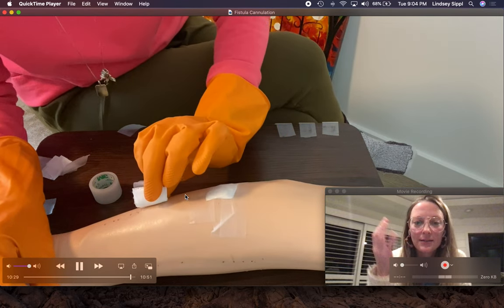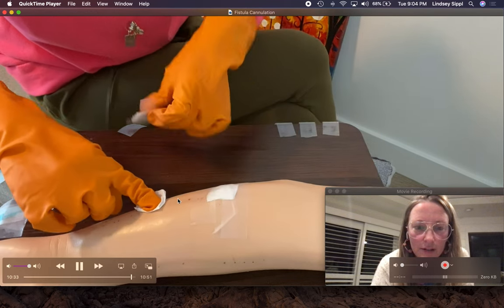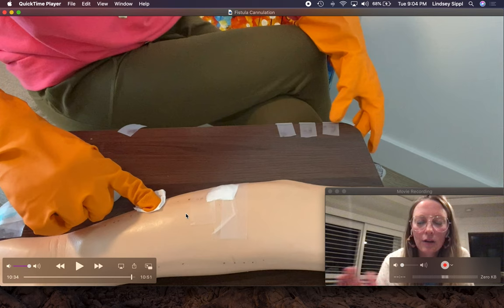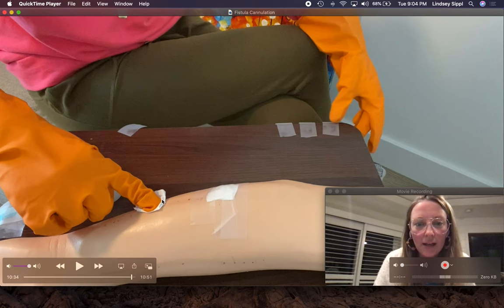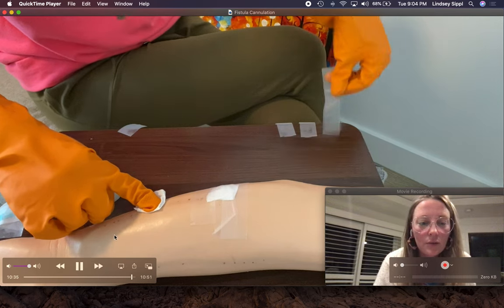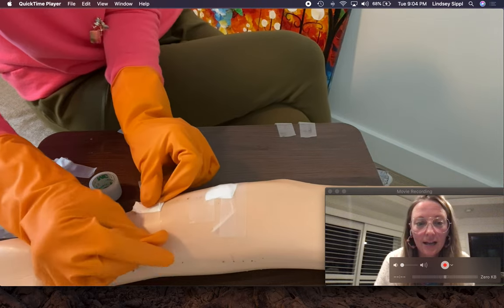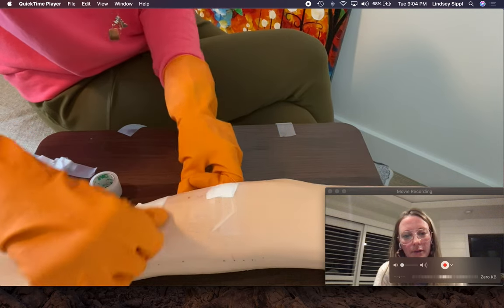I've got all my PPE on — my mask, shield, and lab coat — and I'm going to check to make sure they're not bleeding. You have to teach patients, especially new ones, how important it is. If it's too soon, the blood will shoot right out of there. It is important to check that bleeding has stopped before you let them walk to the scale. I've got three pieces of tape, no shadowing — that site has stopped bleeding.